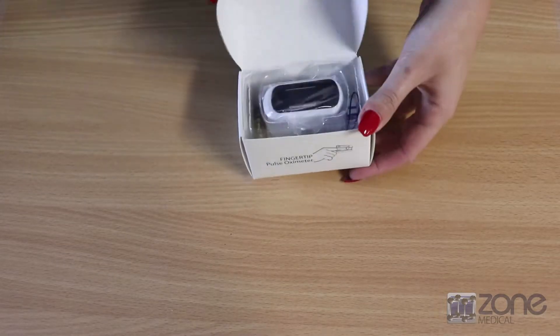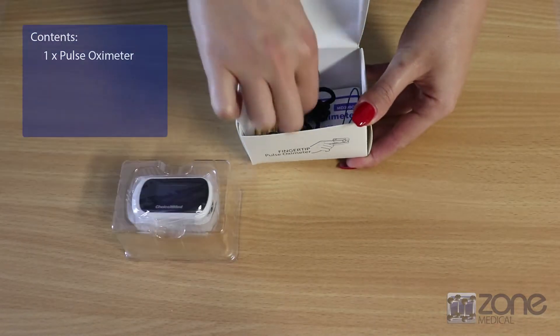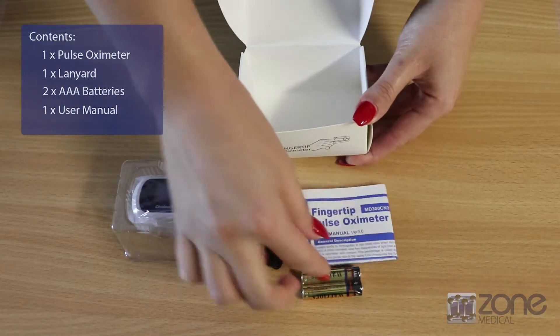Opening it up and doing the unboxing, you get the pulse oximeter, lanyard, two AAA batteries, and the user manual.